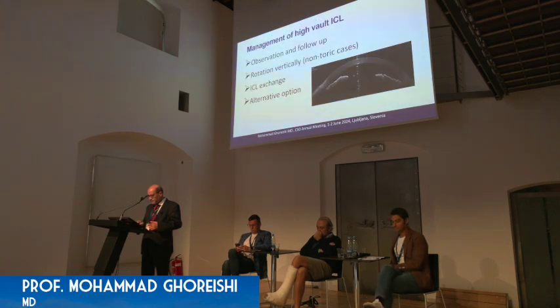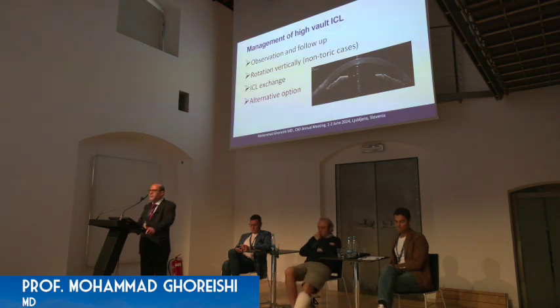And this is for vault measurement. Managing a high vault was already discussed. Observation and follow-up is an option if the vault is not too high or too low. Rotation is another option. And maybe the best solution is ICL exchange.